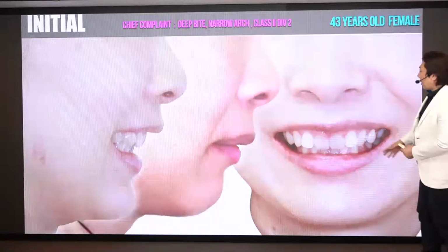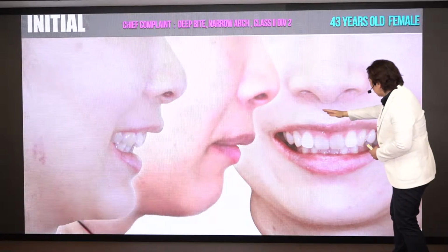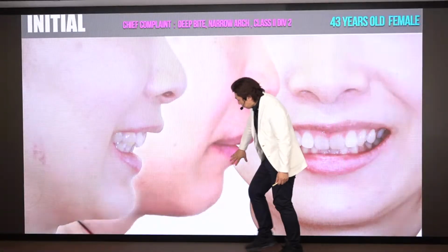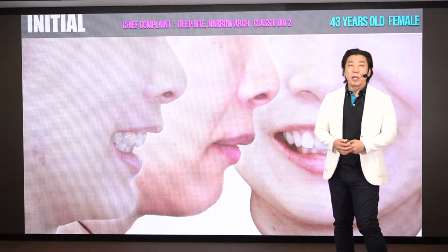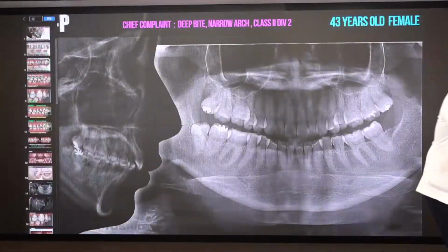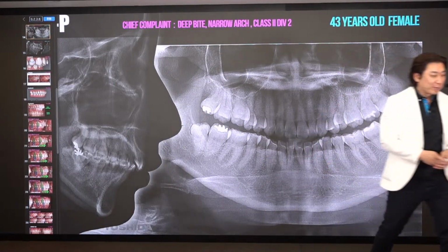How about the look? And the very important thing, the patient's facial analysis. Initially like this, not a good smiling line, and the patient's mandible is just a little bit back, as you can see here. But the patient's chief complaint is just that the upper anterior is a little bit forward.